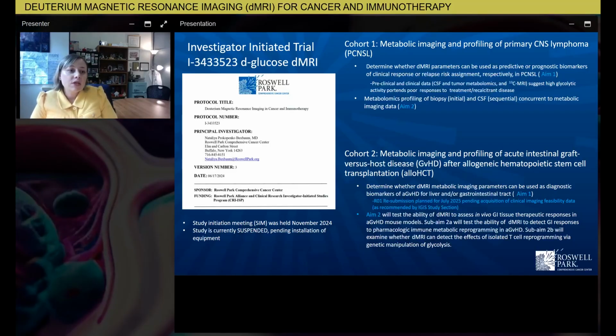And the way we've exploited that for clinical imaging is using radioactive sugar. If any of you have heard of PET scans, positron emission tomography, that's what that deploys. That uses a radioactive sugar molecule, which is administered to the patient either IV or orally. And that sugar will be preferentially taken up by the cancer cells. And that's just uptake, so it gives you a picture of that. But for some diseases, for some tumors, it cannot be used. For example, one place like that is the brain.